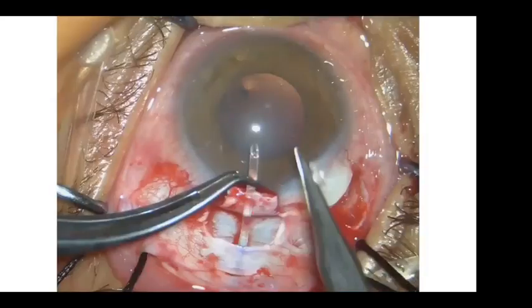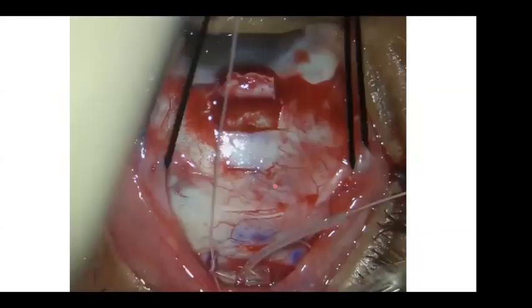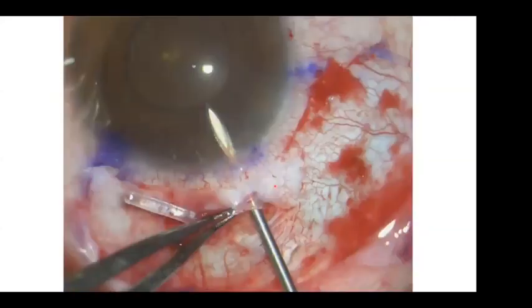Now, while doing that, the remaining part of the tube is short, because in the old days, when I put the implant like 8 millimeter, the tube is around 20 millimeters, so I find a long part of the tube to cut. But once I place the implant, the plate now posterior, the remaining part of the tube is usually not too long. I make it beveled, and then we pierce the limbus using the 23 gauge needle.